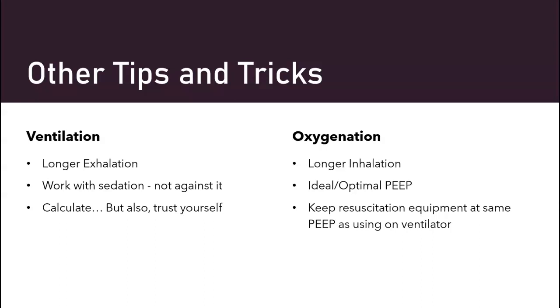Sedation is our friend. So I say work with your nurse. A lot of times if I have a patient that we're really struggling with on the vent, the nurse and I chit chat about sedation goals, and I ask, do you know what the sedation plan is? So I kind of know what to plan with my vent. Are you planning on having them be pretty quiet tonight, meaning they're going to get lots of sedation, or are we going to try to wake them up through the night, which to me would indicate I need to start switching over to a pressure support so they can start breathing more on their own, which would mean more ventilator synchrony.